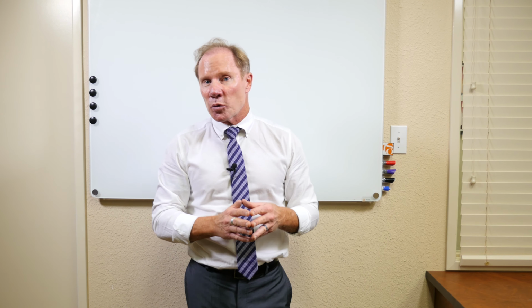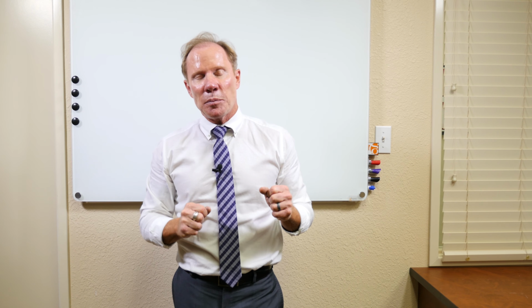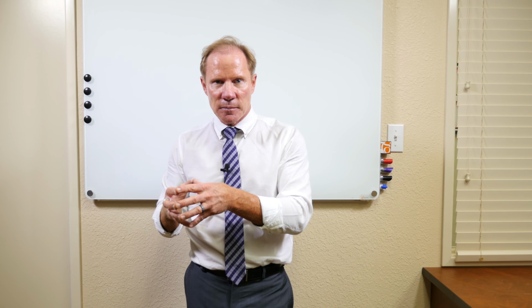Now, bioactive is not new in dentistry. We've been using it for over 25 years, such as some of the coatings put on implants to help with osseointegration. We would see some of the apatite interact with these implant coatings, ideally to help them integrate more efficiently. The product I want to talk about today is called TheraCal LC from Bisco Dental Products.